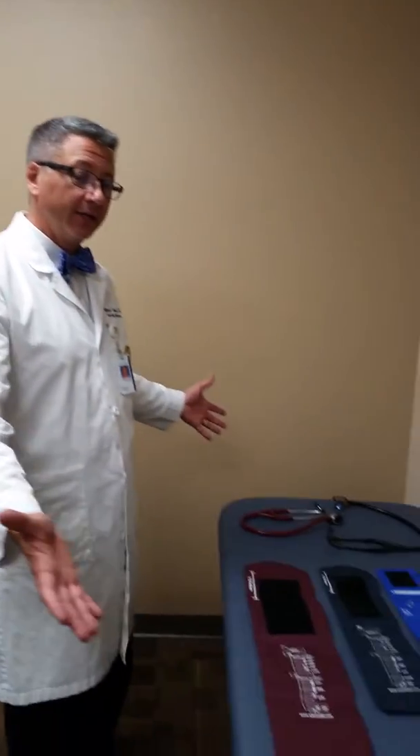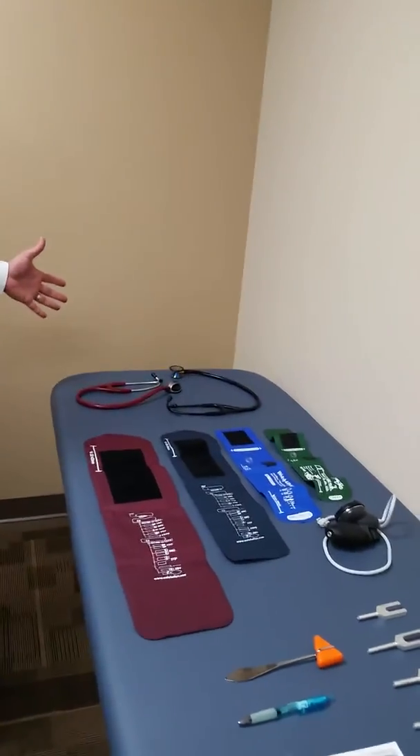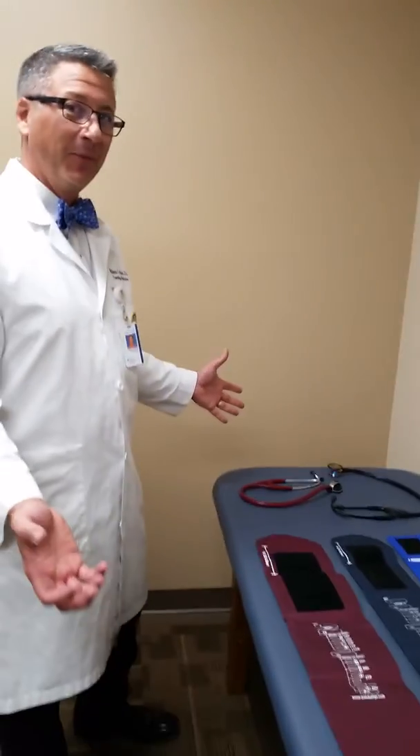Dr. Matthew Carlson and welcome to Osteopathic Clinical Skills. Today we're going to do an introduction to the basic tools of your trade. We're going to start on the far side over here with our stethoscopes.